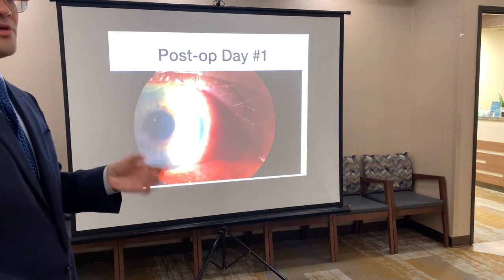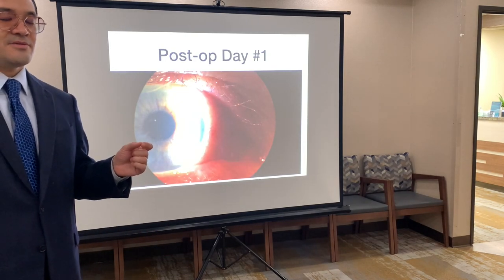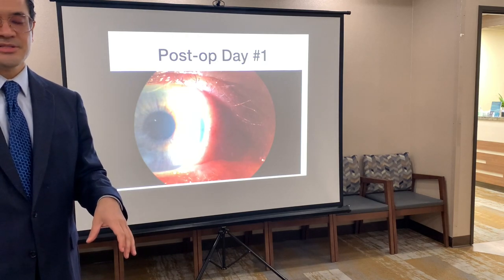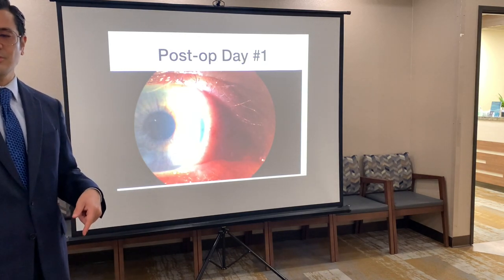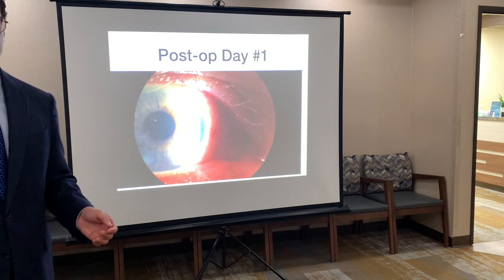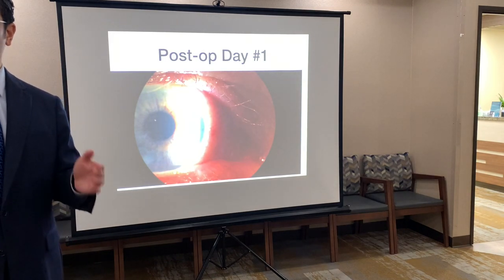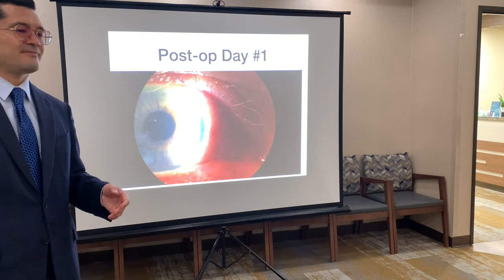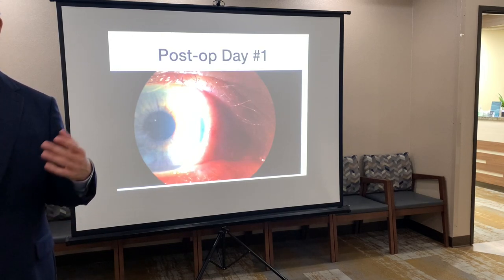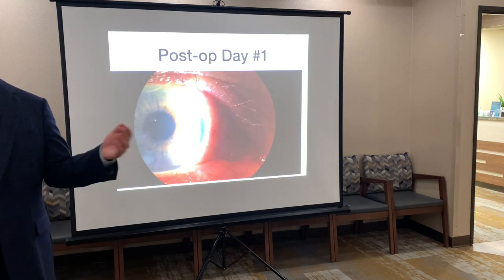This is one of the benefits of femto laser. For the really thick cataracts, even though we have a really good method by hand, sometimes we do like to use a laser on the massive mature cataracts because the laser breaks up the cataract. There's theoretically less damage to the corneal endothelium, so they're less likely to have as much corneal edema on the first day. So when you talk about some of the benefits of the femto laser, I think that's a really good one. If you have a medium or a regular type cataract, it's not going to be any consequence. But if you have a massive cataract like this, I think there is a small benefit to the femto laser. You're going to break it up with the laser, and that means our ultrasound doesn't have to do as much work to remove those pieces.